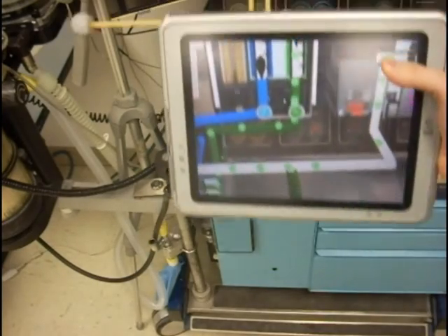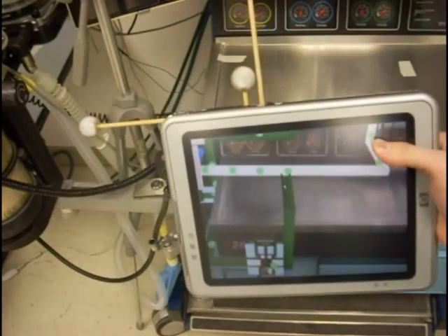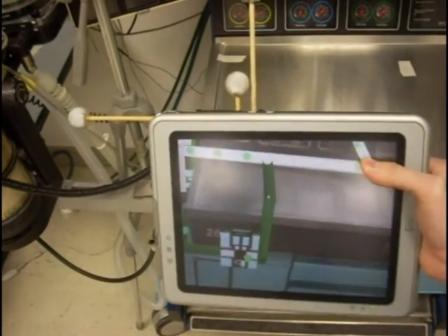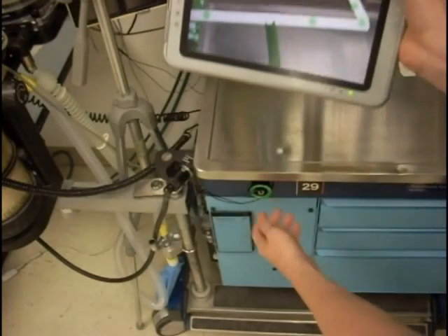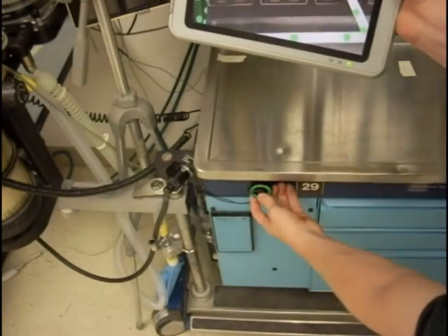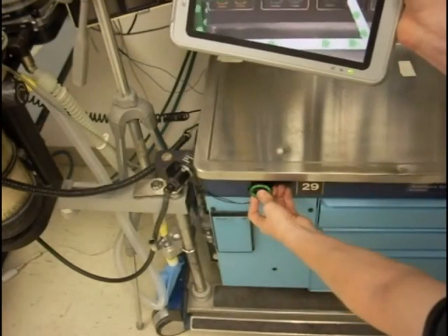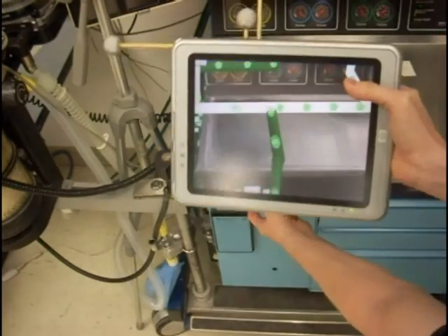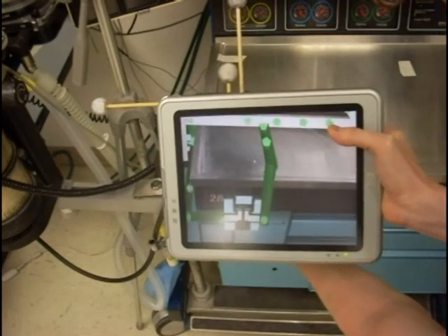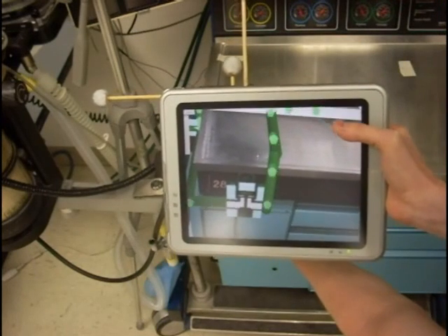The flush valve flushes the oxygen through the system. The user presses the button to open the valve and can visualize the valve opening and the increased flow of oxygen.